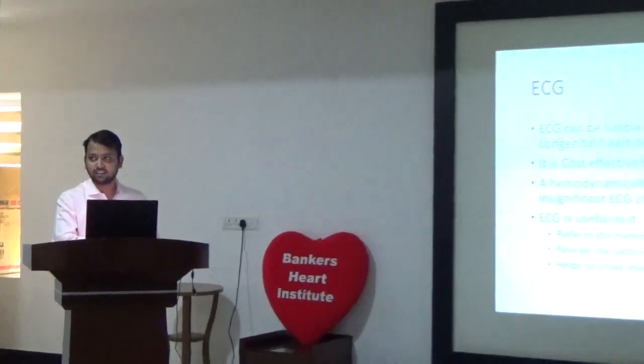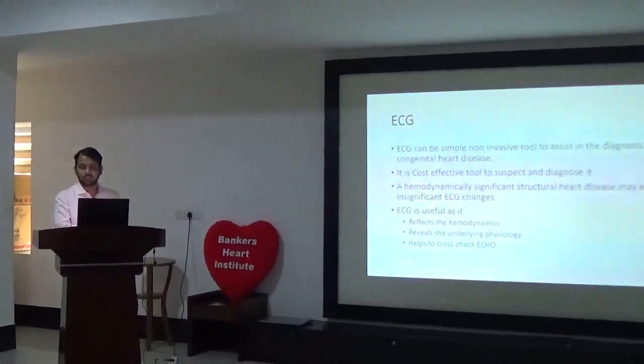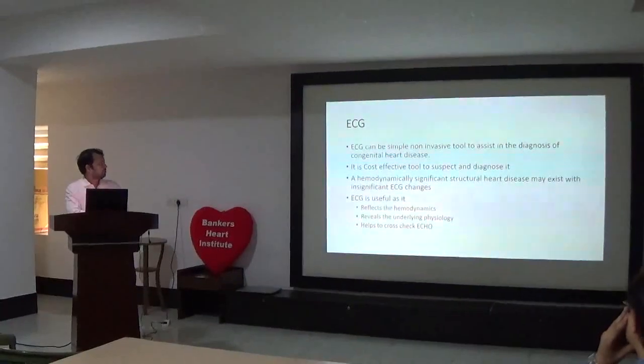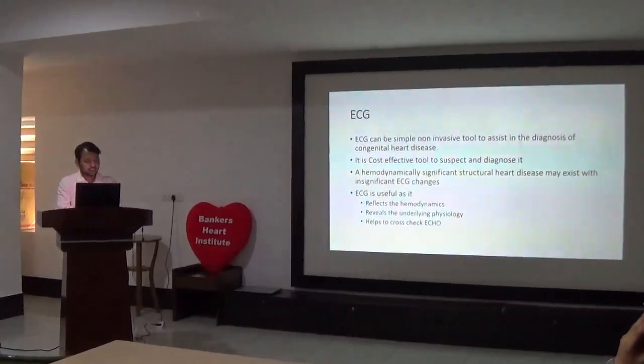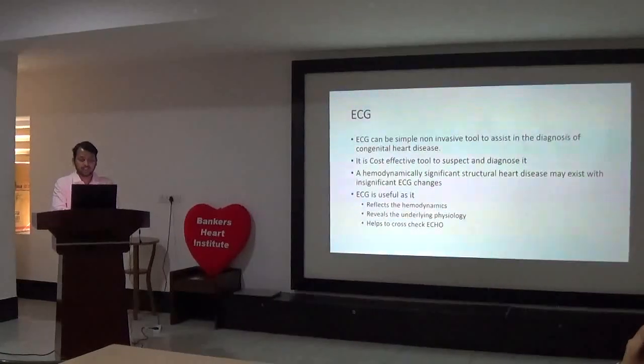But what are the uses of ECGs in congenital heart disease? I will be discussing this in today's seminar. ECG can be a simple non-invasive tool to assist the diagnosis of congenital heart disease. It is a cost-effective tool to suspect and diagnose it.